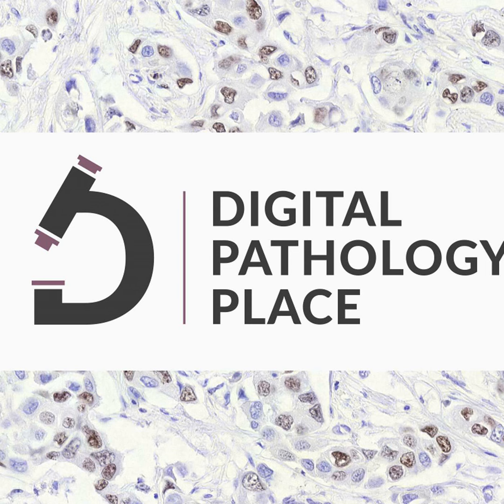Well, even the Philips solution didn't have to be the way it is. They could have used the DICOM standard in their product. They elected not to, because the DICOM standard predated their product and their approval. Why did they elect not to? Why do people elect not to if it's already there? Let's say they're starting development from scratch. It's there. You don't have to think, you can adopt it. Why do people choose not to? It's a very interesting question. People convince themselves that their homegrown invented technology is in some way better. And in the case of Philips, they had a wavelet-based compression scheme, because lossy compression is needed for practical digital pathology.